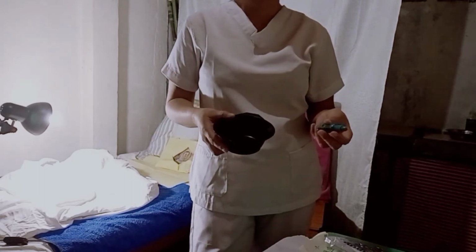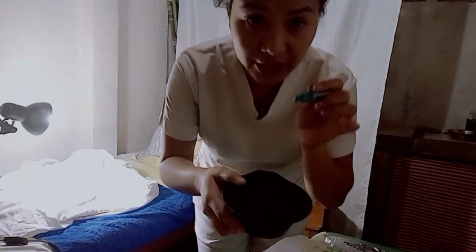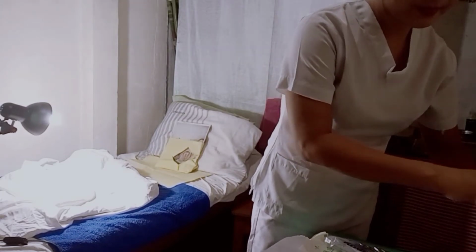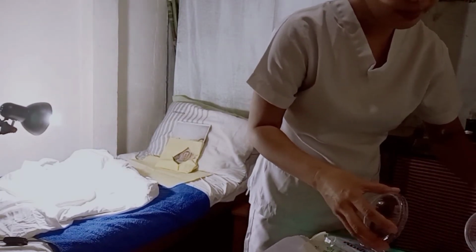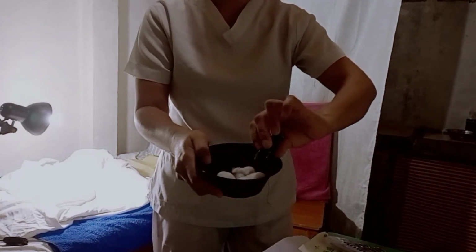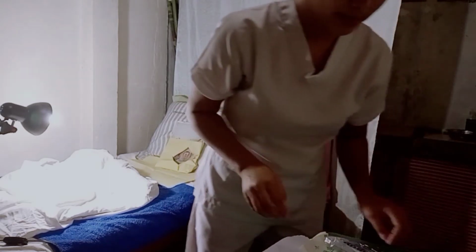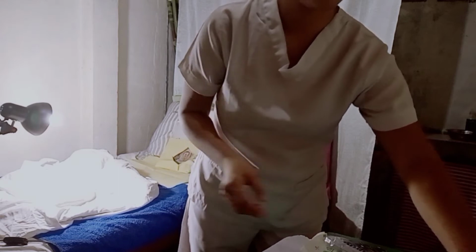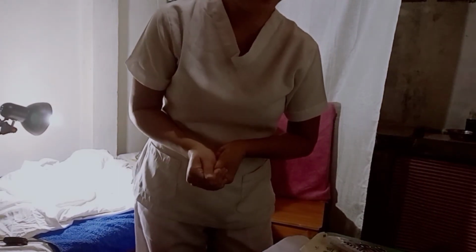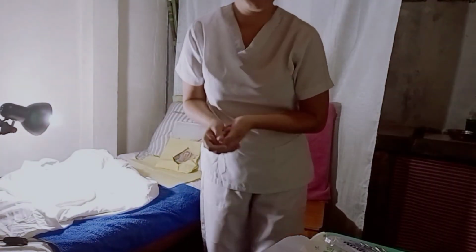And then pour antiseptic solution over the cotton balls. The rationale for this is that it prepares the cotton balls for cleaning and avoids contaminating other items in the kit.